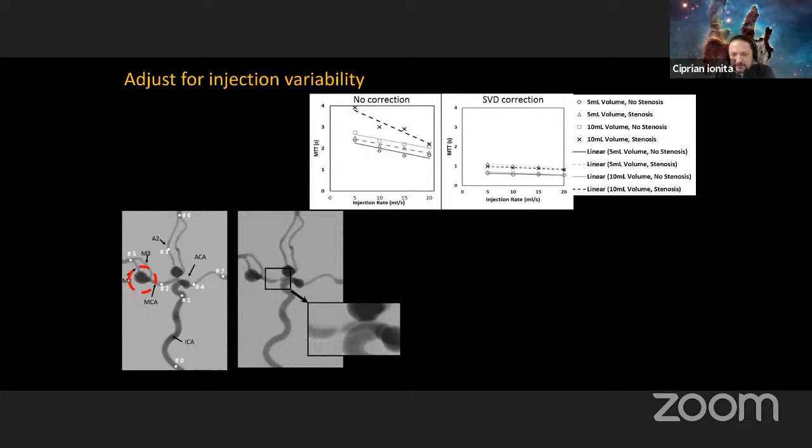That means a very short injection with a lot of contrast, as if everything happens in a fraction of a second. So it brings variability down to that type of simulated injection and its parameters.